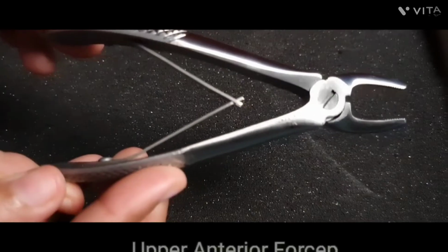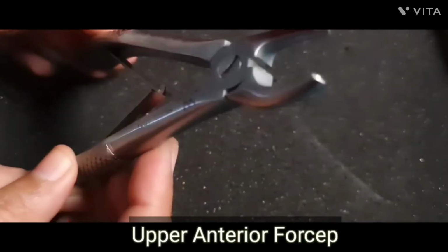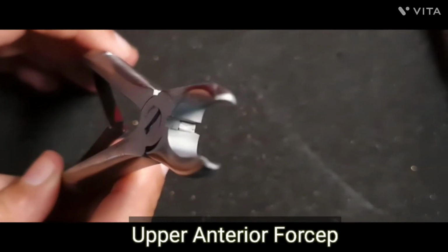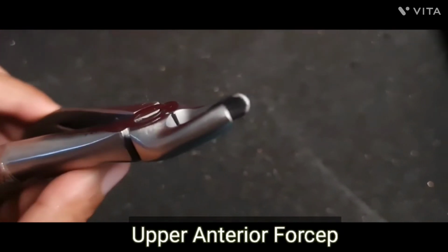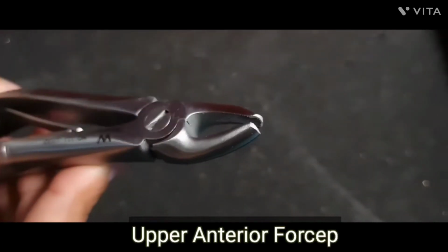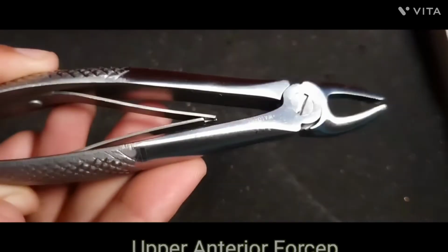So this is the upper anterior forceps. Apply the forceps beak to the most cervical area and then use clockwise and anti-clockwise rotation to extract upper anterior teeth with the help of this forceps. So you can see this is an upper anterior forceps.